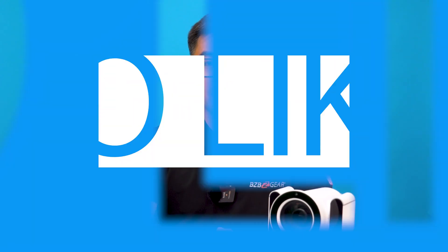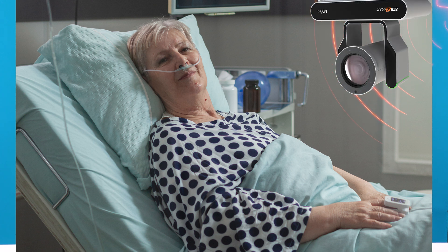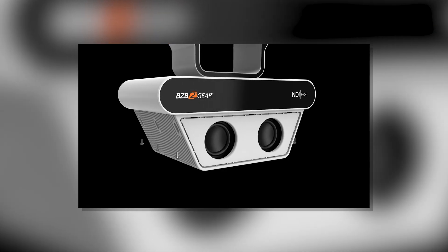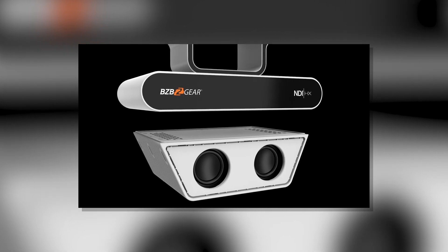On top of all this, NDI HX3 delivers uncompromising image quality with ultra-low latency. With built-in stereo speakers and a microphone, the BG Nutrix facilitates clear communication between healthcare professionals and patients, as well as remote patient monitoring. The Nutrix also has the ability to play pre-recorded messages through the software or the SD card.